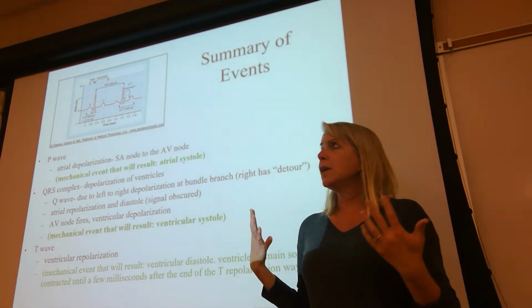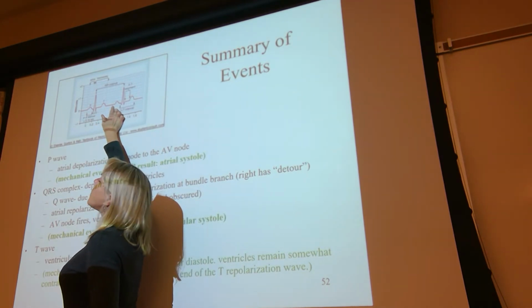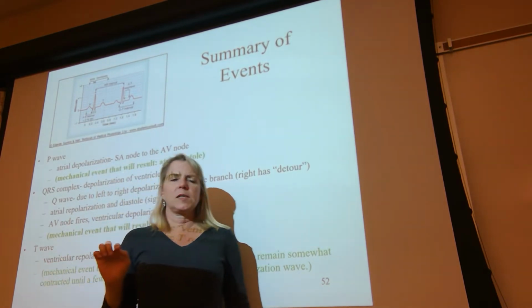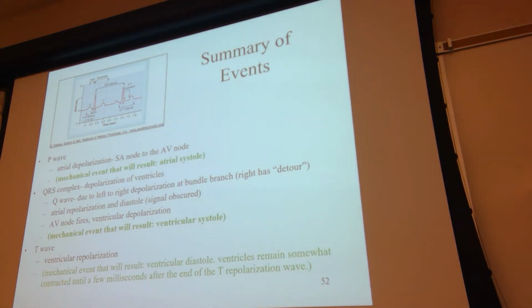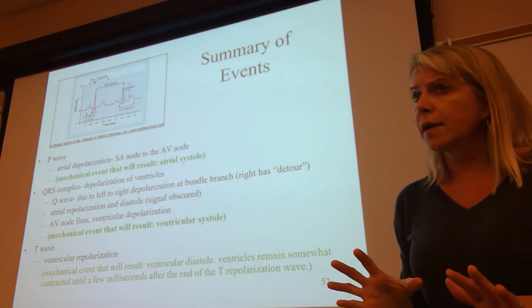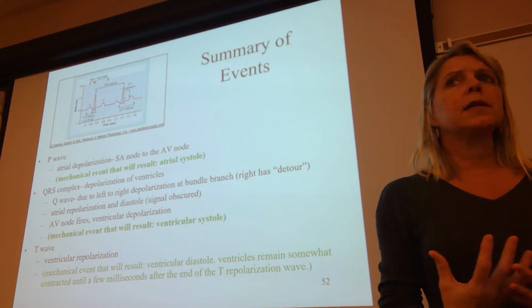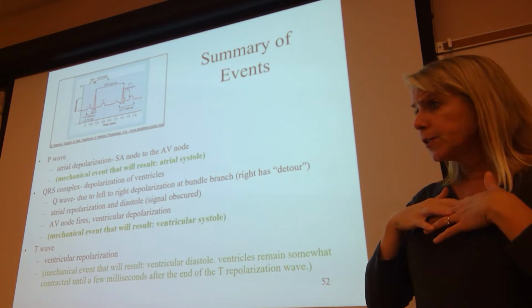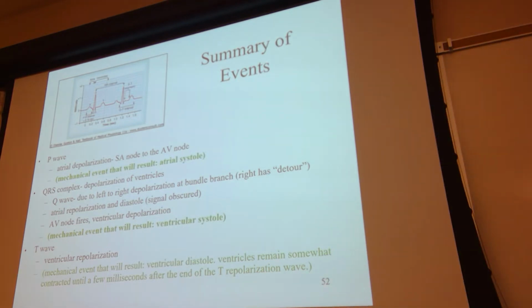At the end of the T wave, we now have the pen going back to baseline. Does that mean your patient is dead? It just means there's no electrical current moving and the heart is at diastasis. Remember, all 4 chambers are relaxed, and now we're getting blood returning to the atria and pouring straight down into the ventricles, and we're getting filling again.